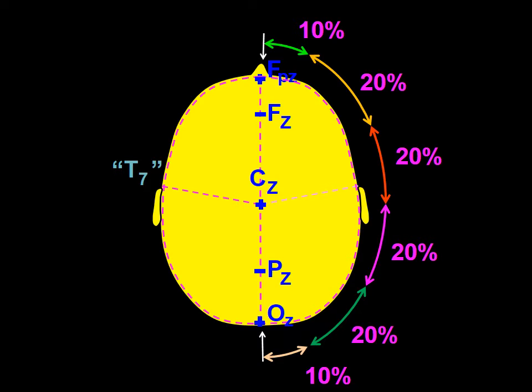I like to emphasize that the percentages given here correspond to half the head circumference, but if instead we consider the full head circumference, then the percentage would have to be half. But for the moment, it is fine to keep it as we have done from the beginning.